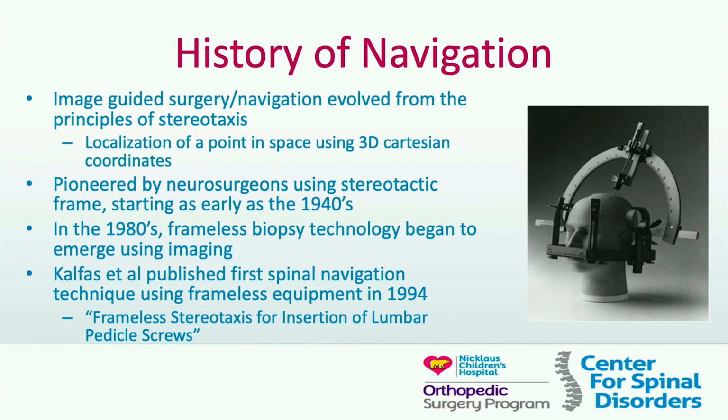No relevant disclosures for this talk. And again, I'll go through some of this early stuff pretty quickly because it was mentioned previously. But when we talk about the history of navigation, it really evolved from stereotaxis, or localization using a 3D Cartesian coordinate system, pioneered by the neurosurgeons in the 40s, but then in the 80s used for frameless biopsy technology. And then in the early 90s, there were some studies published on frameless stereotaxis with insertion of lumbar pedicle screws.